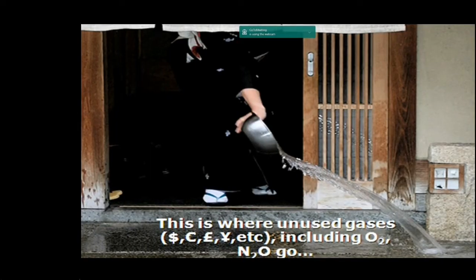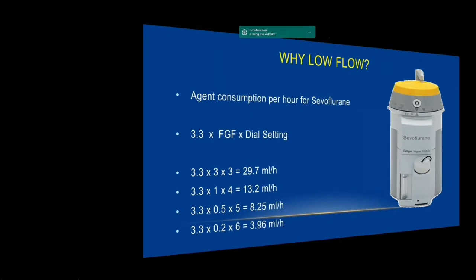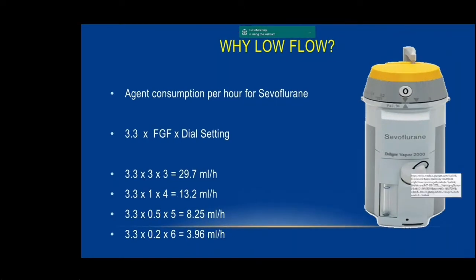What do you do using your open circuits or Bain circuits? You are using very, very high flow. What essentially you are doing is you are throwing your hard-earned money down the drain, literally. You want to know how? I will explain to you in short.